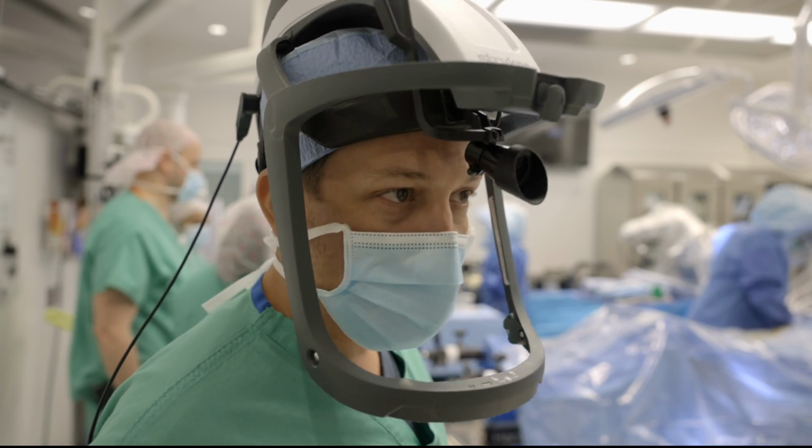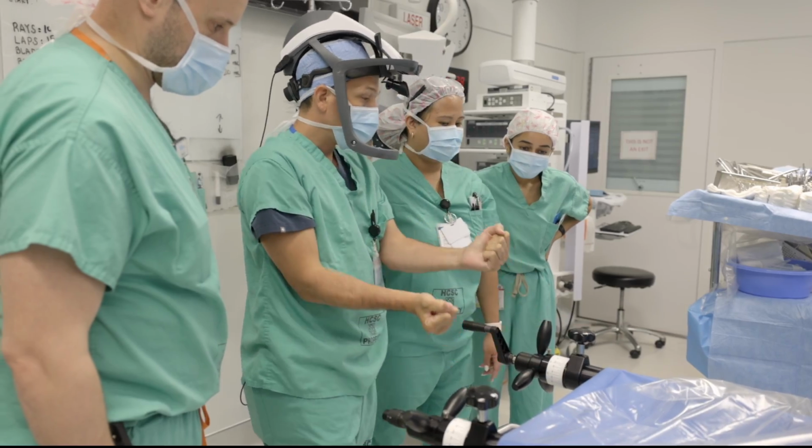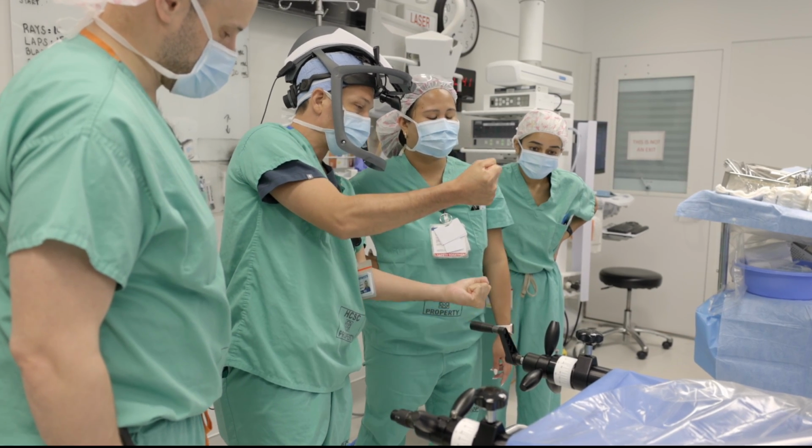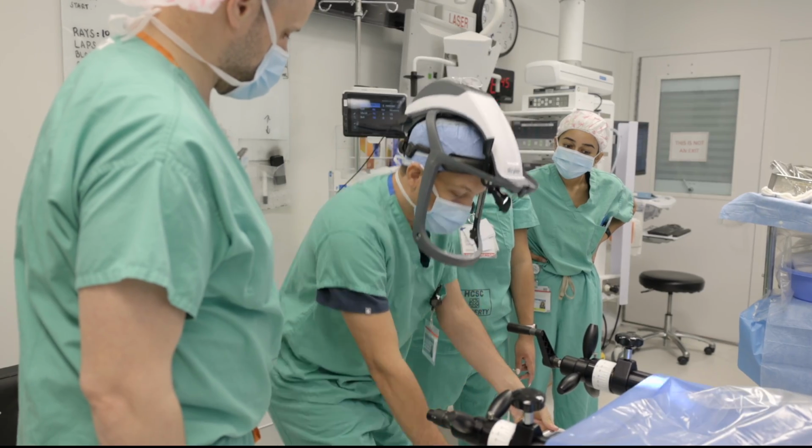It's better than eyeballing it, right? If I'm eyeballing it, it's not going to be as precise. External 130, and it's all the way to 130. We're going to go down with the leg, then go all the way down.